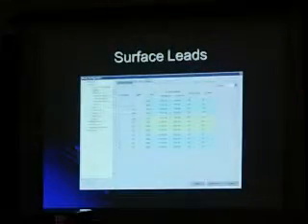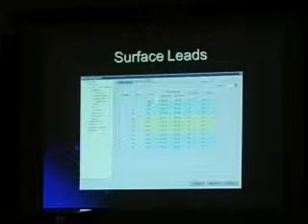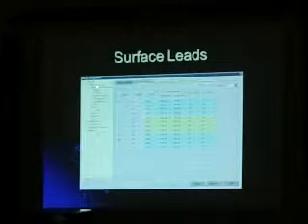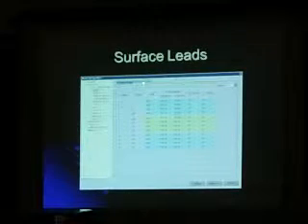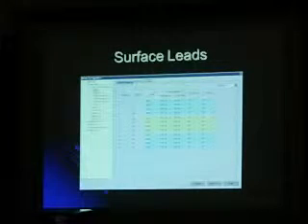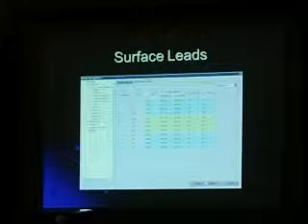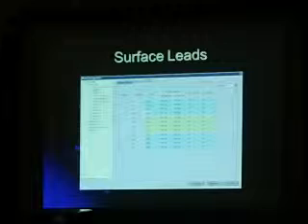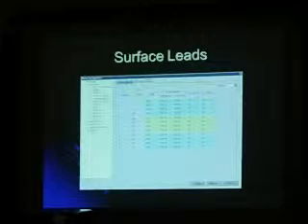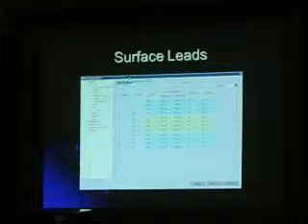So our surface leads, when we build them, are pretty straightforward. When we bring up our study configurations, we have all the different blocks and different things. And then we have 2 tabs, and the first one that pops up is your display settings. The reason that pops up is that's usually the one you're going to want to use while you're doing this. Because that's where you're going to turn it off, turn it back on, maybe change its name, maybe change its color. Okay? It's this other one that's important when we're starting, because these are our hardware settings.